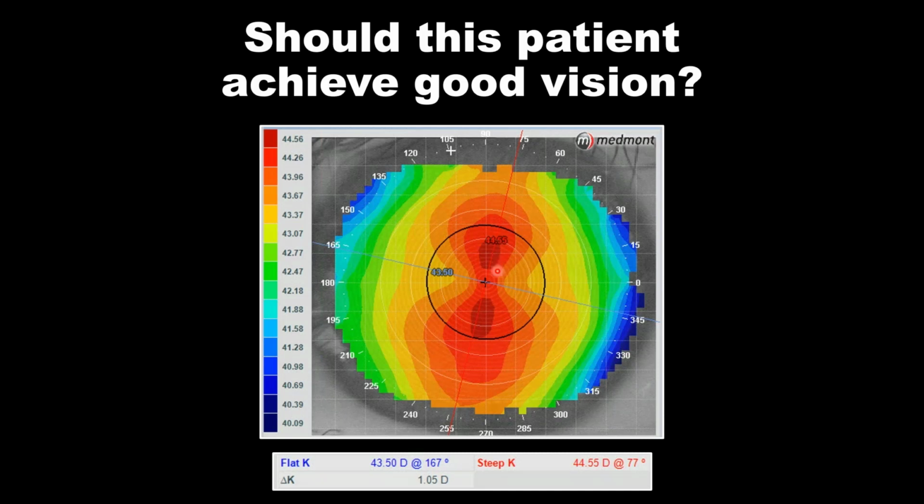We also notice that the inferior hemisphere is a mirror of the superior, nasal a mirror of the temporal. The power distribution within the pupil across those two meridians is really ideal. It's really symmetric. So providing this patient with good acuity, with glasses, with soft lenses, with rigid lenses, with anything really is a non-factor, should be quite straightforward.